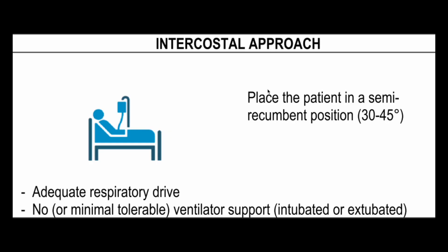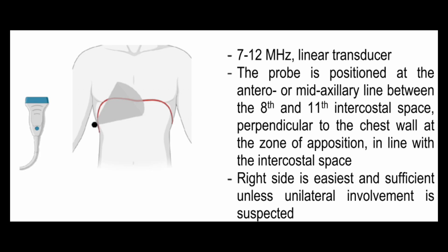The second approach is the intercostal approach — between the ribs. Place the patient in the same semi-recumbent position and check both respiratory drive and ventilatory support criteria as discussed. Use a linear probe at 7 to 12 MHz. The probe is positioned at the antero- to mid-axillary line between the 8th and 11th intercostal spaces, perpendicular to the chest wall at the zone of apposition.